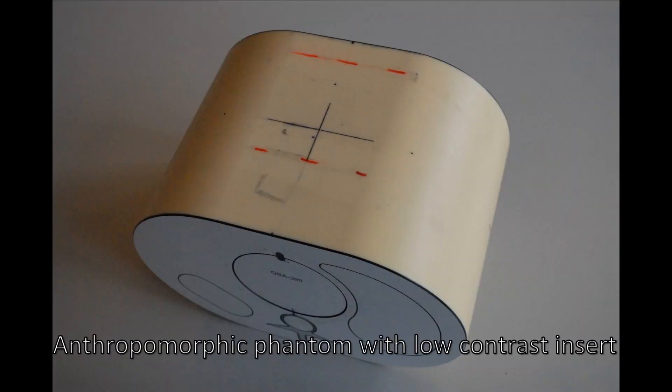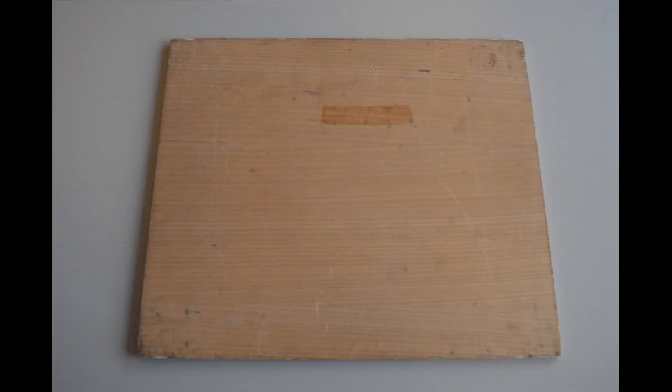Finally, we will describe the manipulation of the QRM series phantoms. You will need an anthropomorphic phantom with low contrast insert and a wooden plank of low density.